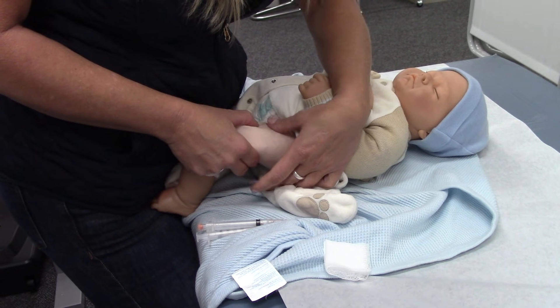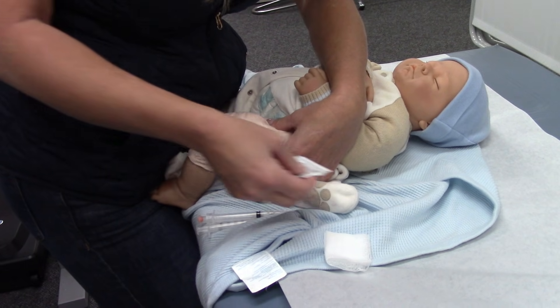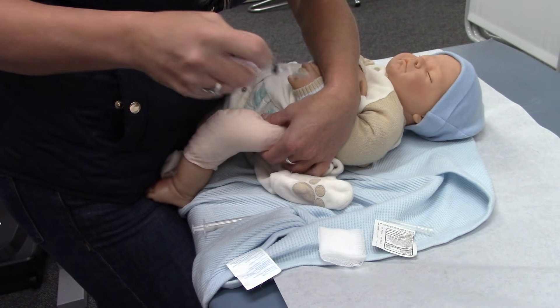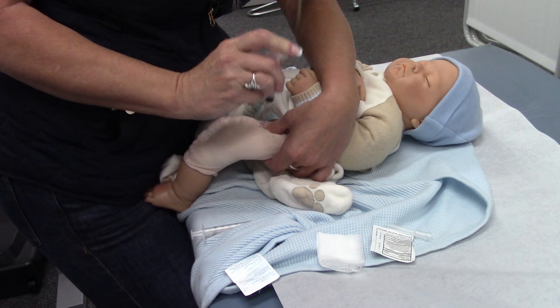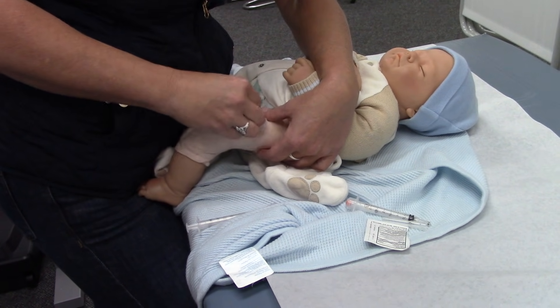I like to put my thumb on the femur and push out the mass. Clean it. And with a one-inch needle, I'm going to go directly in. Inject and then out. And then massage. Band-aid.